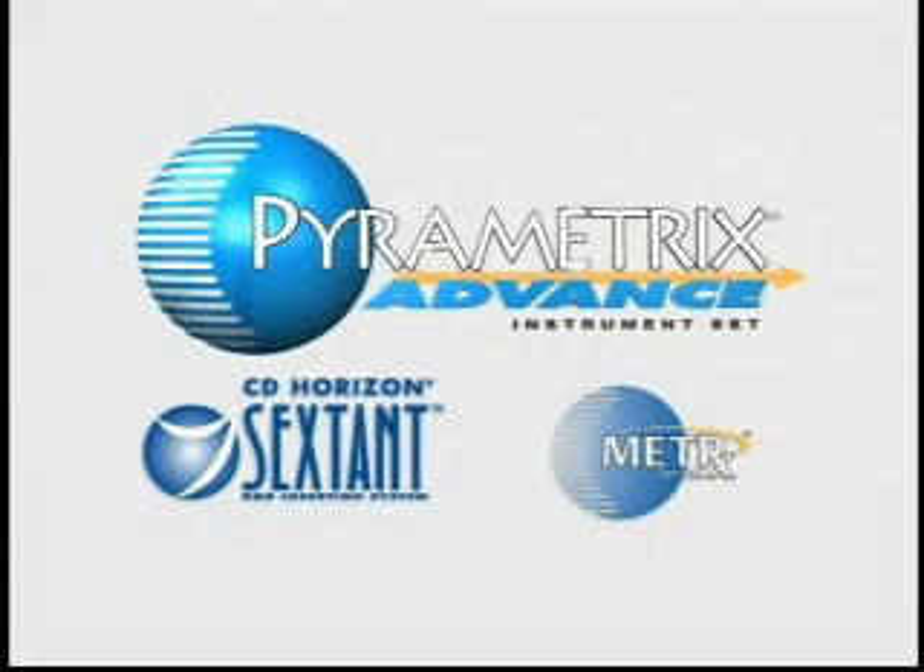The Pyrametrix Advance Instrument Set is specifically designed for both open and minimally invasive procedures, while providing precise endplate preparation and better visualization.